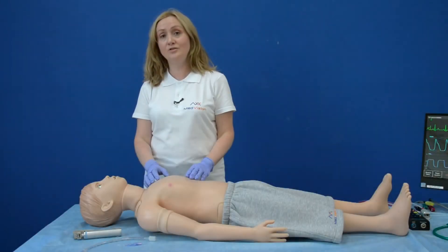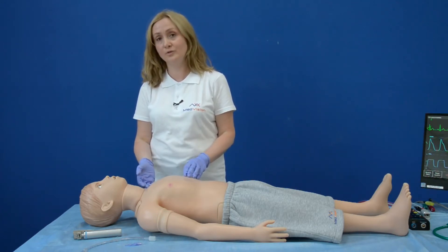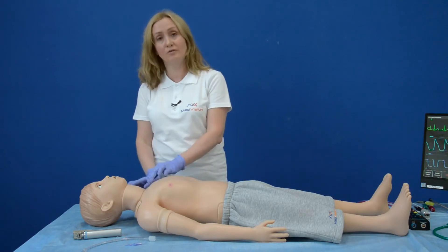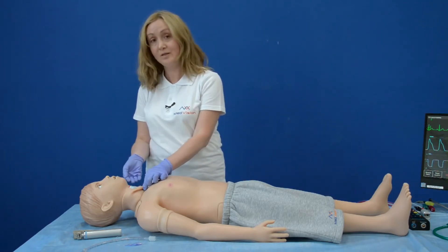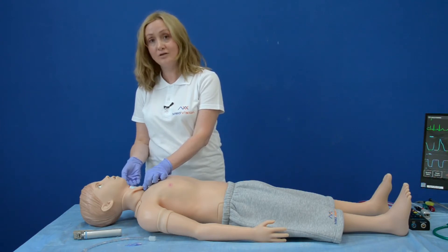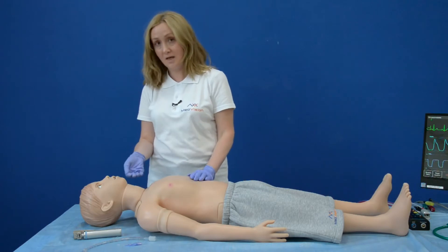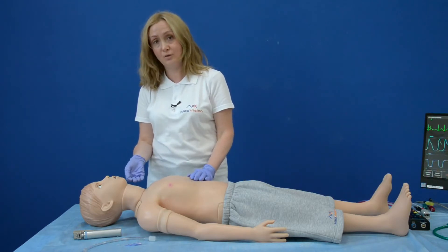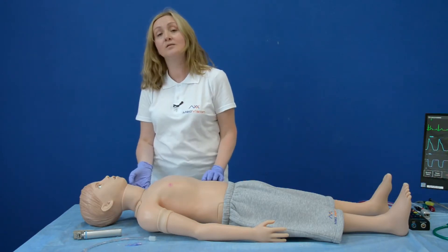In addition to intubation procedures, you can also perform invasive procedures such as cricothyrotomy. For these purposes, Arthur is equipped with a special replaceable part which you can change every time you finish the exercise. If you want to repeat the exercise, the only thing you need to do is move the neck skin and continue using the simulator.